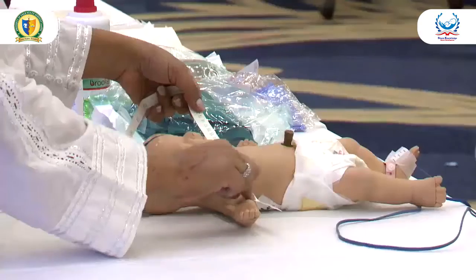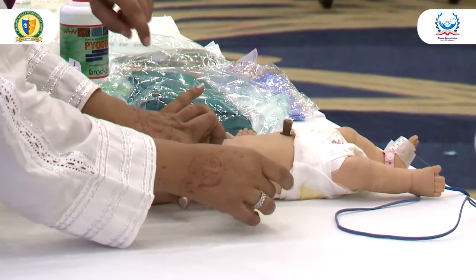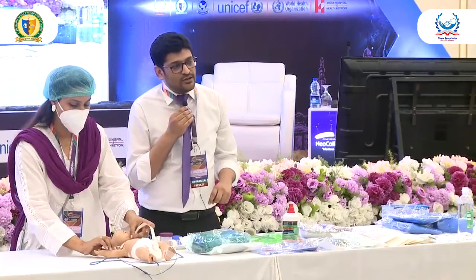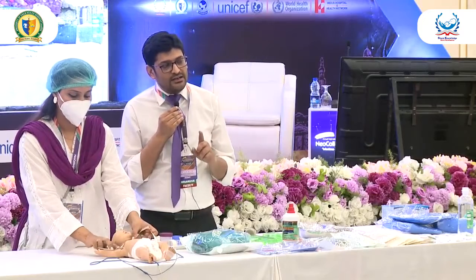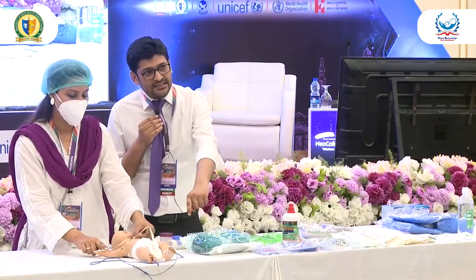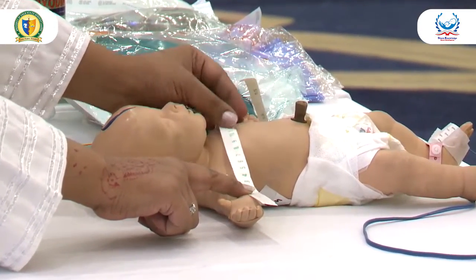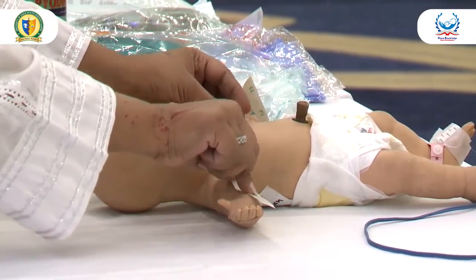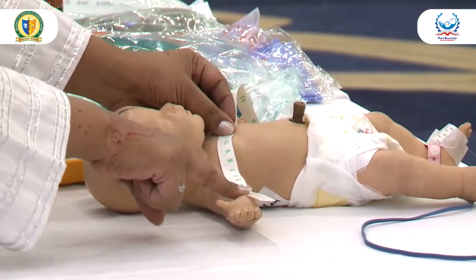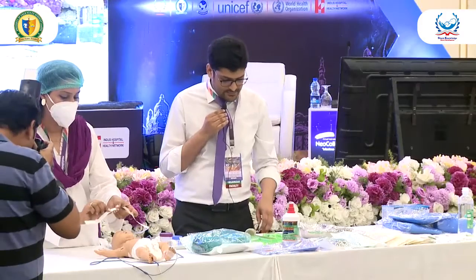We will measure along the course of the vein to the sternoclavicular joint of the same side, then downwards till the third intercostal space. So our desired length of insertion is 12 centimeters.